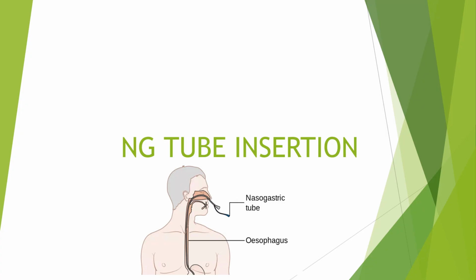Today we'll look at insertion of an NG tube, nasogastric tube, and in my image there you can see an NG tube that has already been inserted to the stomach. So appreciate the image.